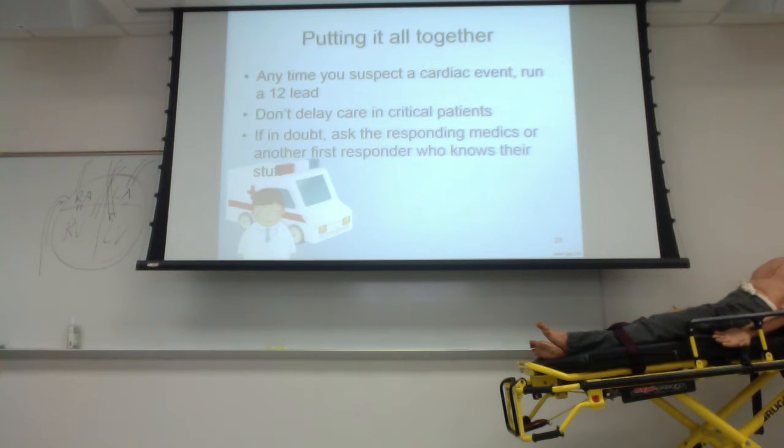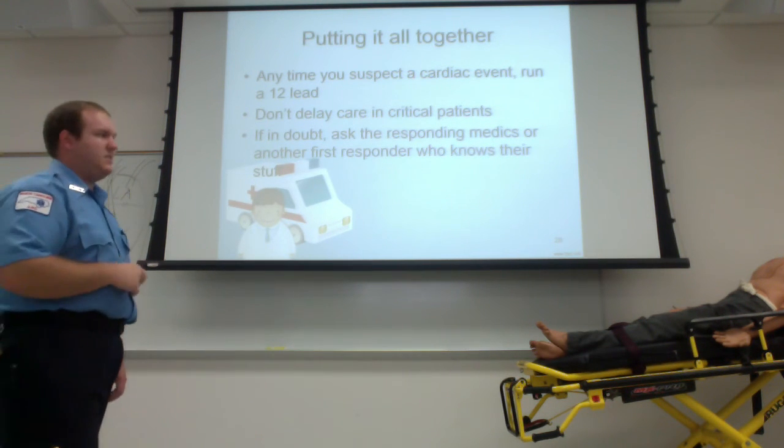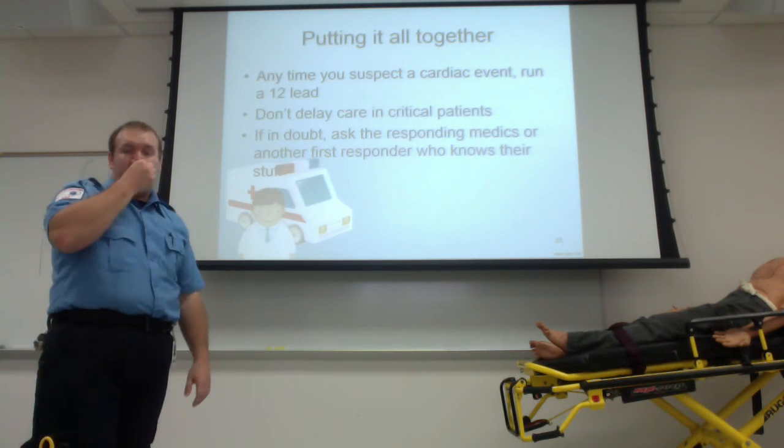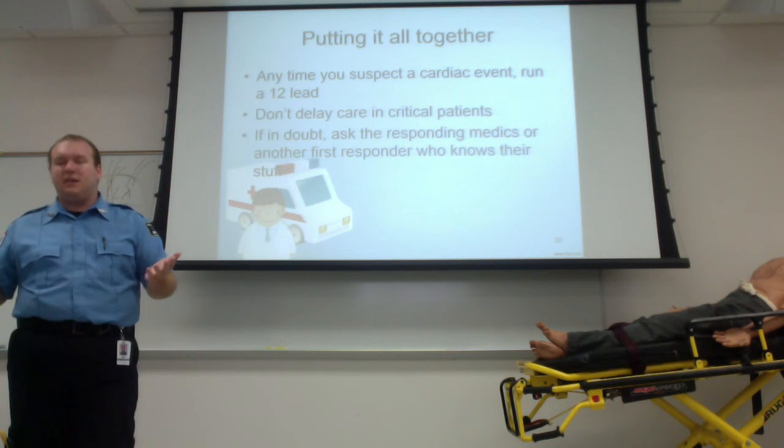So as we start coming together here, we'll get ready to do a little bit of practical work and actually put on a 12 lead. Anytime you suspect a cardiac event, go ahead and run a 12 lead. You're not going to be dogged at all, any reason at all.